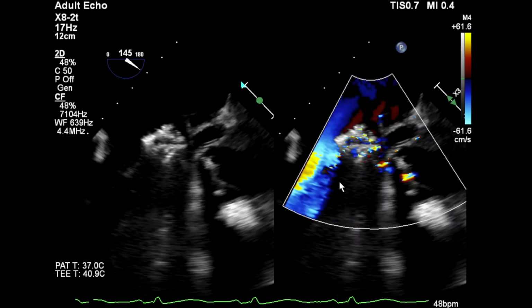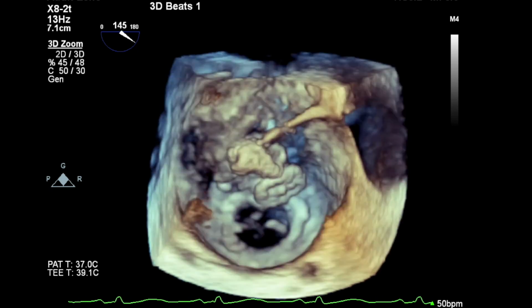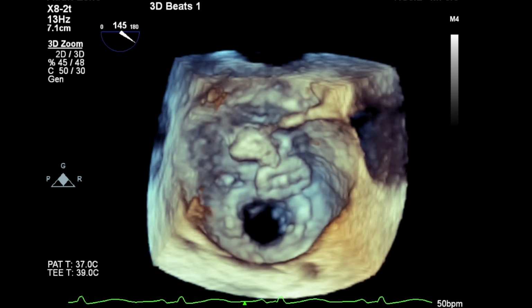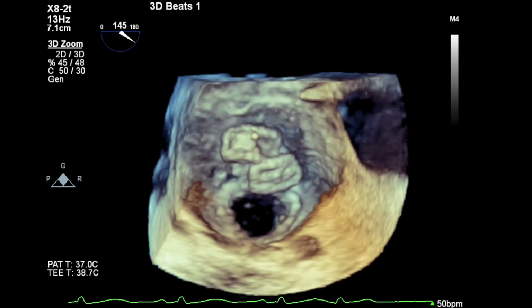So now we've got a choice. I think I'm going to release the Occlutech device first because I think I want to see how that shapes. And as it releases, as Bushra said, the tension on the device disappears. The device sits down better. The two discs look good. And actually, the left atrial disc is above the AVP3 disc, so it should interlock nicely.